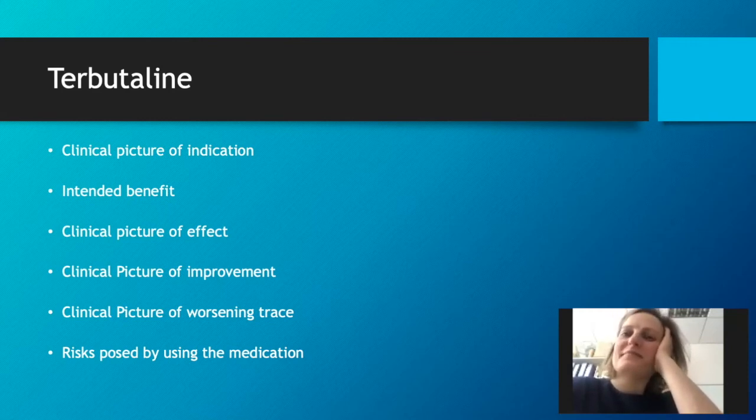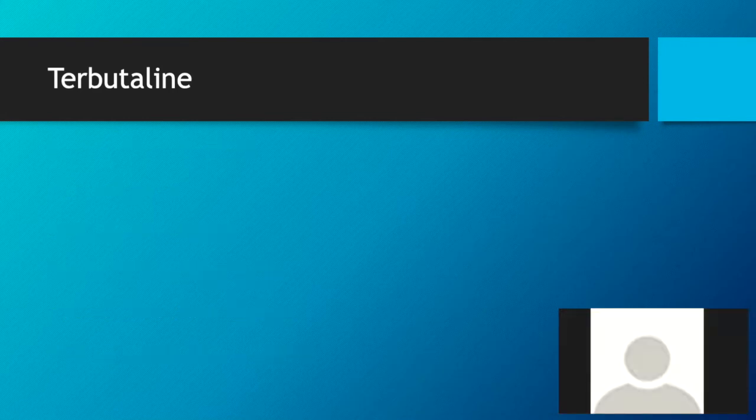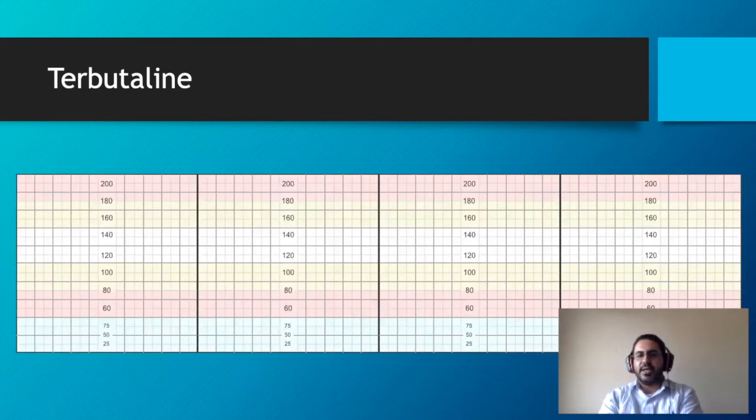Thank you. Okay, so did you guys understand this about thinking about the clinical picture that you were already seeing while you're tocolysing? Yeah. Now, this is something that we always talk about when we're giving terbutaline. We generally tend to give it with a baby that is showing it's becoming unwell, and it's usually that this baby is going through gradually evolving hypoxia. So the picture that we're looking at is usually that the baby's baseline has gone up because the baby has started secreting adrenaline. So the baby's basically started compensating, which is going to take the baby's heart rate up.